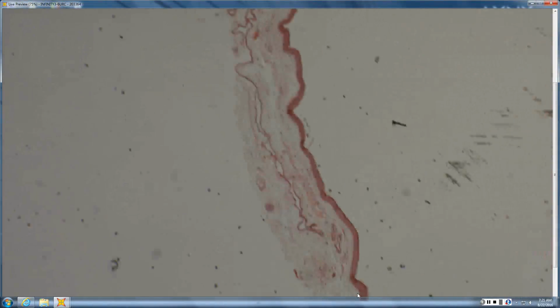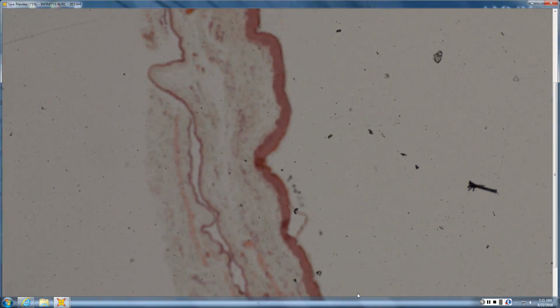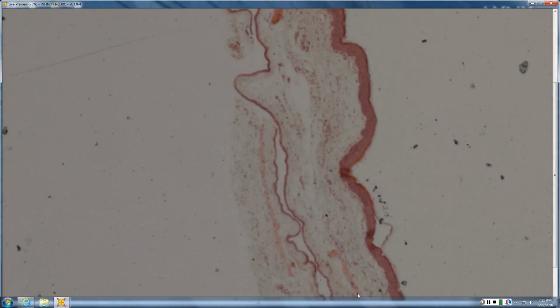Almost done. Okay. This is a hydrocystoma. This is usually on the eyelid, or actually a periorbital location. Very, very common. We see them not infrequently. Very thin. They've usually been popped basically, so it's just this thin, two-layer thick cyst that's on thin eyelid skin.